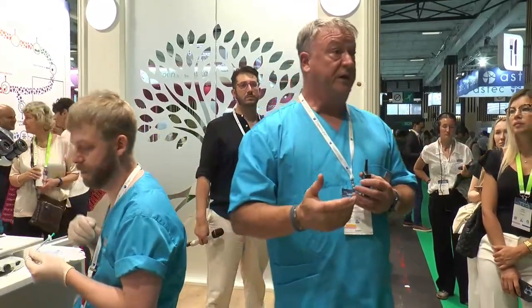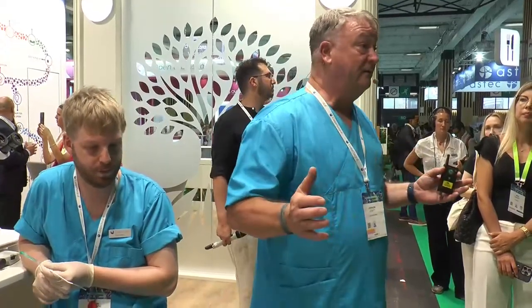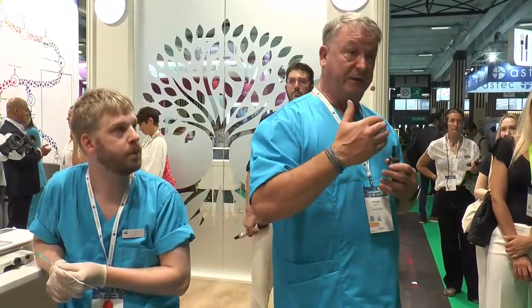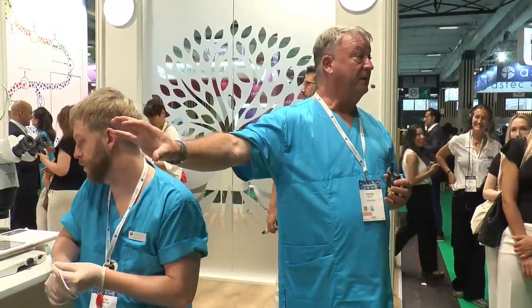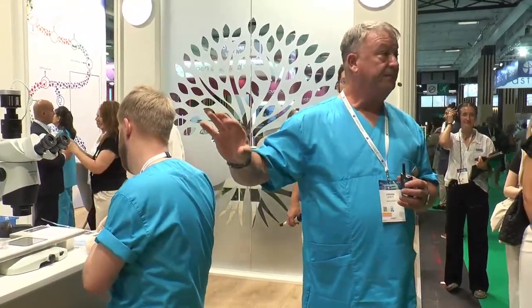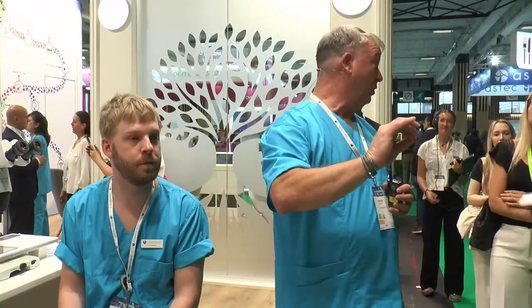But what we don't want to do while you're learning is just use a patient as our guinea pig, because they're totally invested in the outcome. And when you're learning, you're not going to be as good as you are when you've done 200 embryo transfers. So thankfully nowadays we have something that can help us, and that's a simulator that can help us work through a number of transfers, a number of different anatomies, so that we've got some skill base before we move to doing patient work.